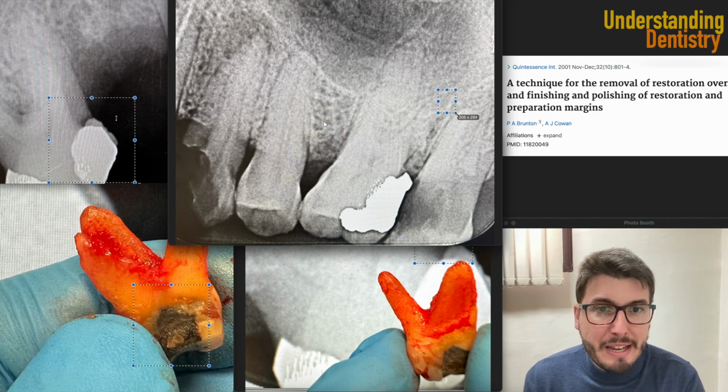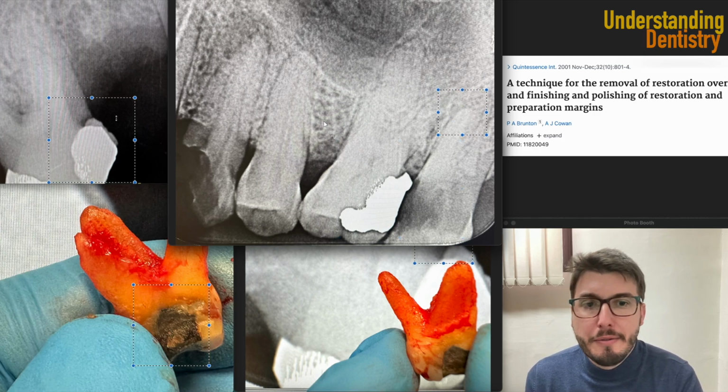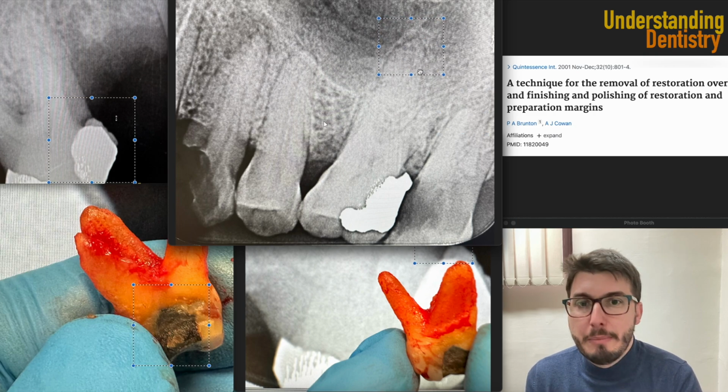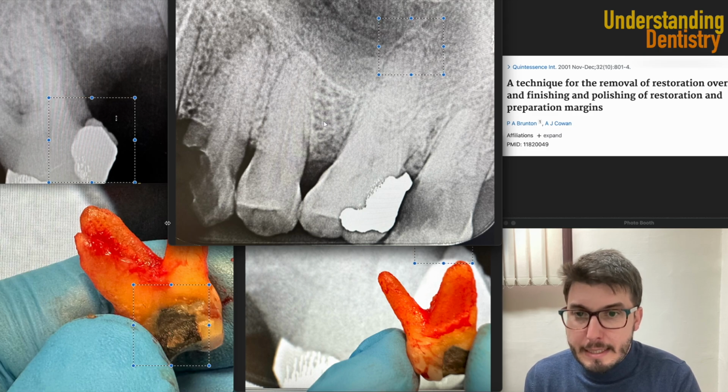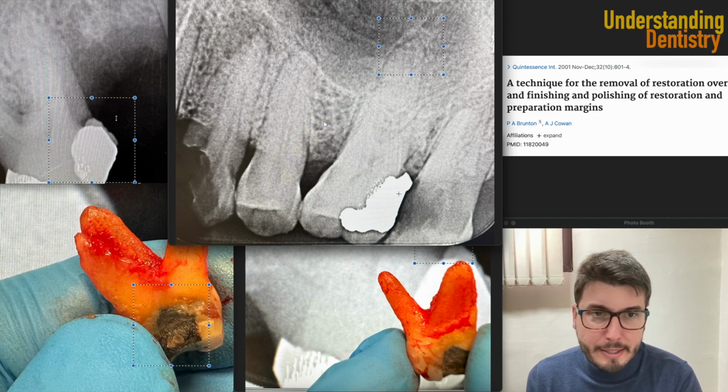That's why we are even having radiolucent alterations here of the second molar as well, periodontal ligament space widening on the palatal root of this tooth, and that's it. So that's why we need to do that.